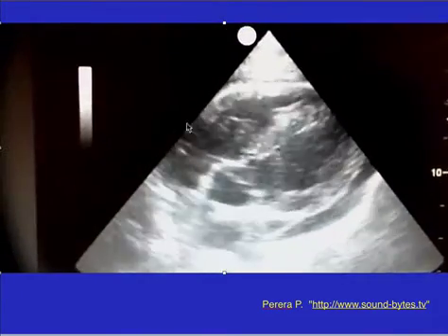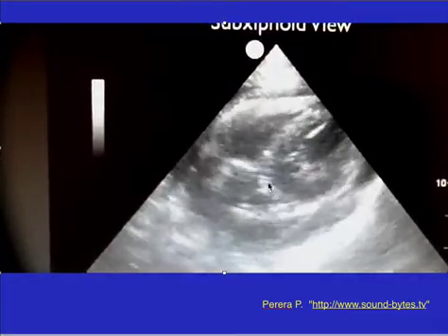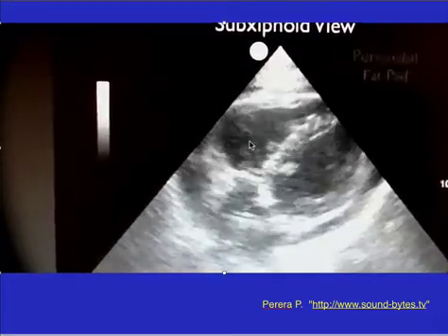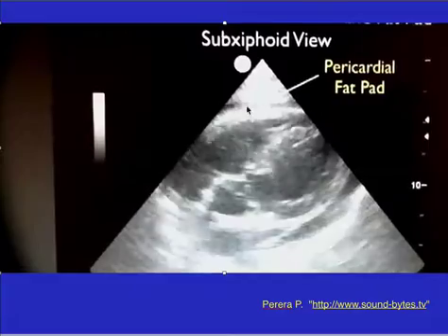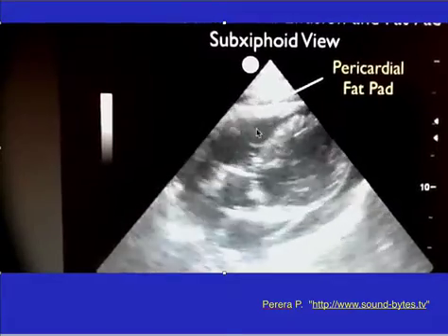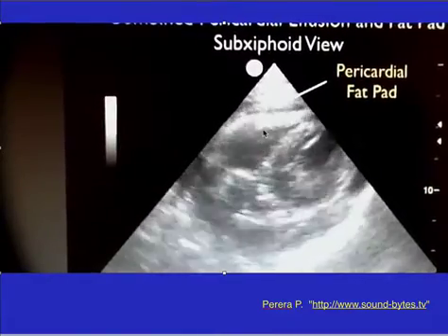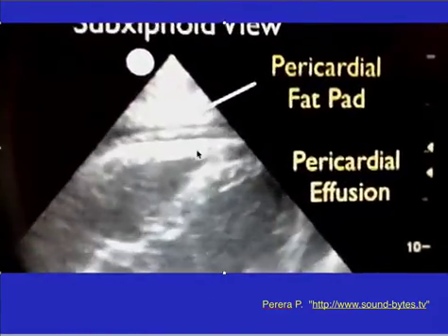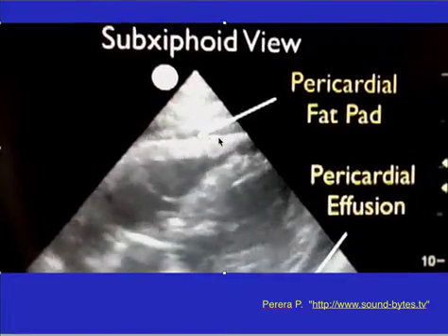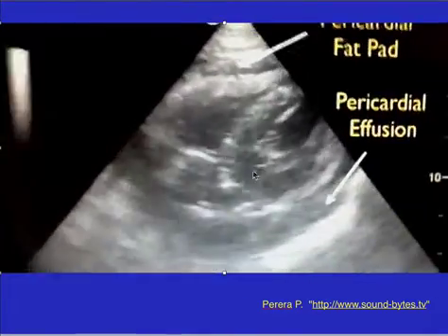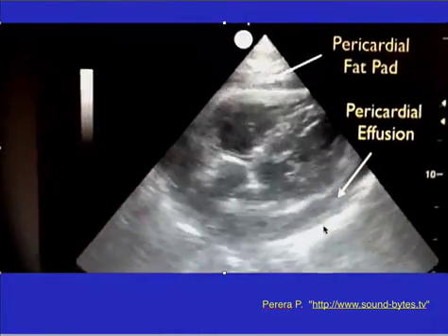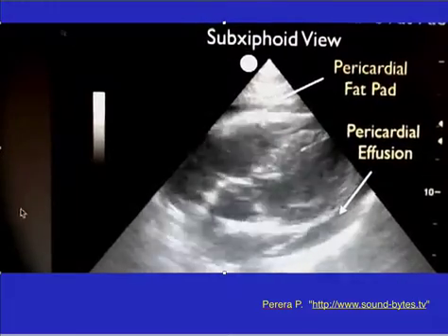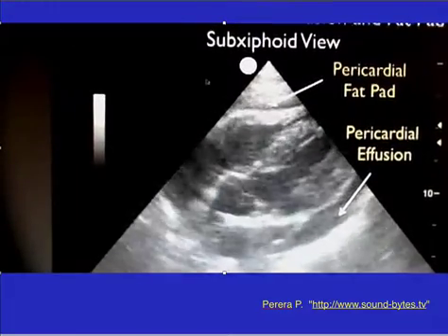This is a sub-xiphoid or subcostal view — you know that because you see liver up here. You can see the right ventricle, which is the closest chamber to the chest wall. You can also see a little pericardial fat pad and a pericardial effusion.